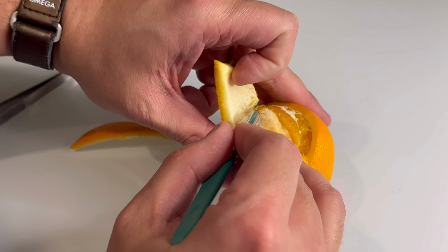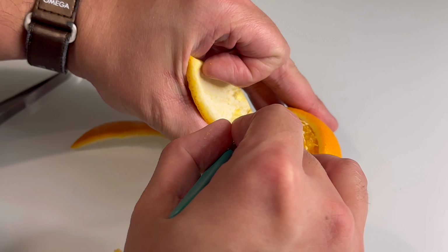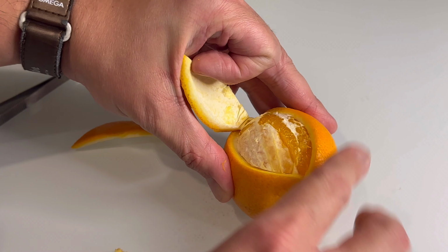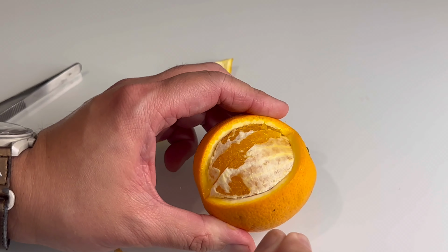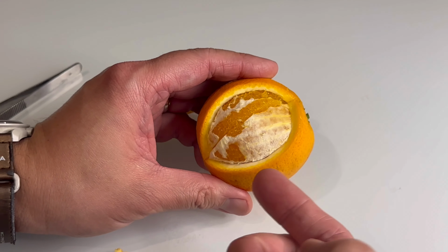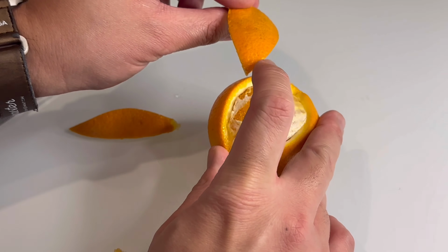So what is the point of the knife? Why not just bluntly dissect everything? The point of a knife, or with cautery, is actually to be able to allow it to be divided at the exact site where you want to take it off. If you exert too much force with blunt dissection, it may tear either under or above.